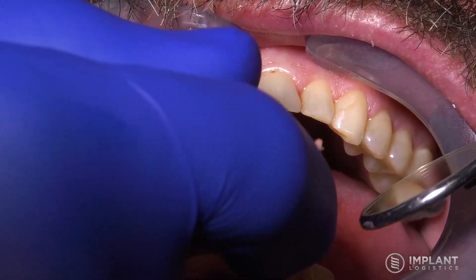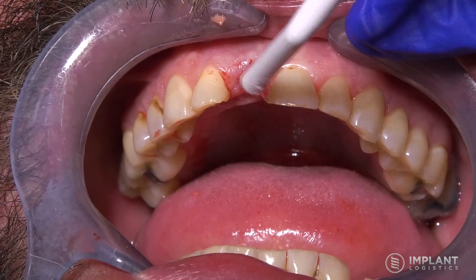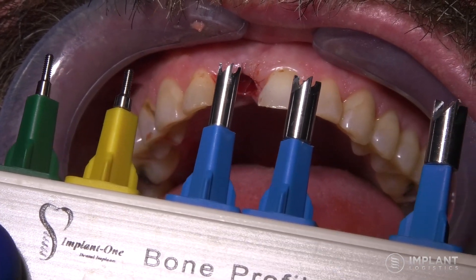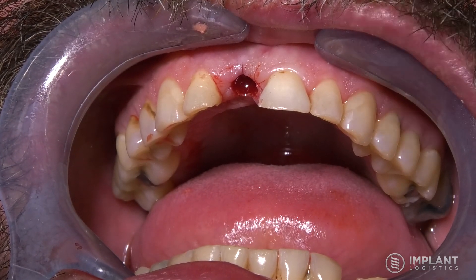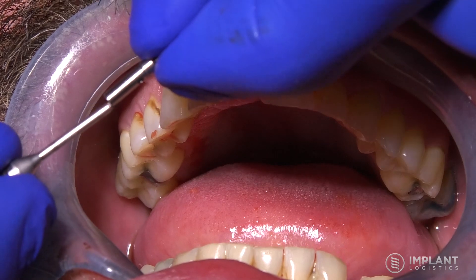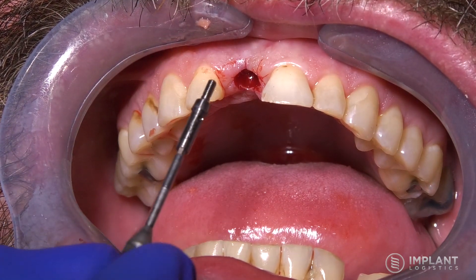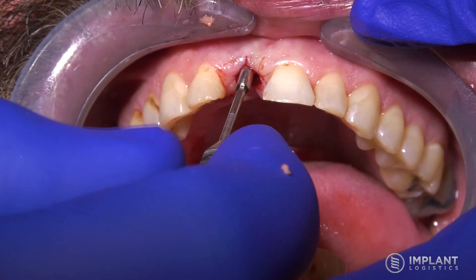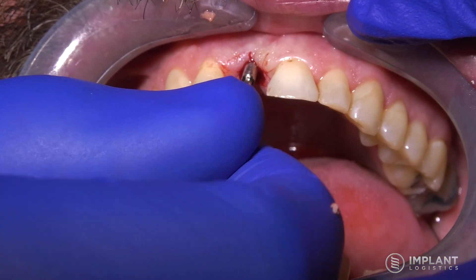Now you're looking at the bone profiler kit. Implant One has two different platforms — Series One and Series Two. The yellow is Series Two, so we know just from that that this is an implant that's 4.0 millimeters or bigger. The cover screw is removed, the pin is placed into the implant and screwed down — just hand torque down to the top of the implant.